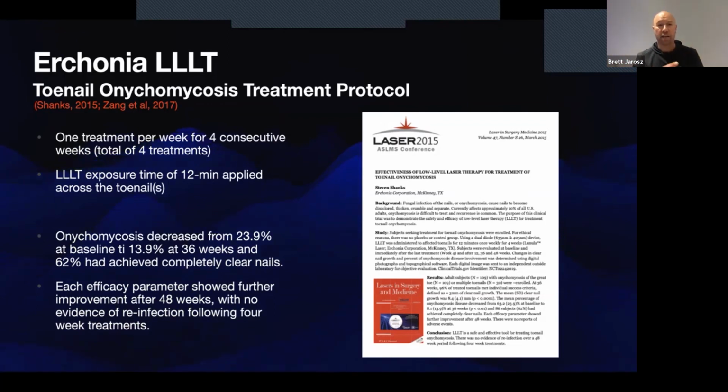This was a case that has said that she's done everything, has tried all the different sterile socks and shoes and changing all that, obviously medications, creams, all the different podiatry interventions, etc., without any success. And after 1 treatment, so I saw her for the second time today, she'd already said to me that her toenails have not been flaking.